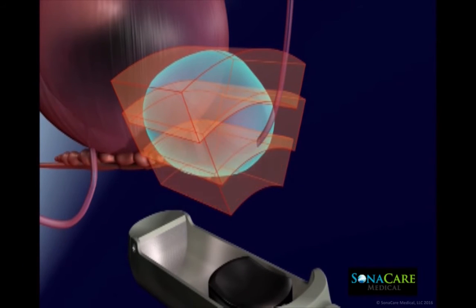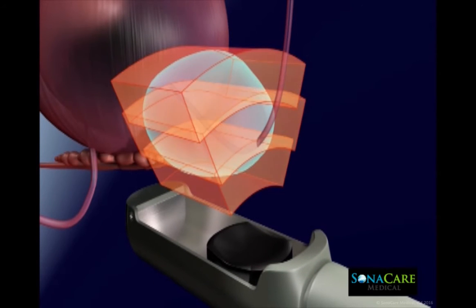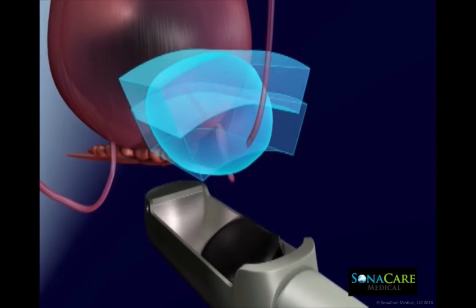Sonoblate features a two-sided transducer allowing customizable applications with focal distances at either 4 centimeters or 3 centimeters.